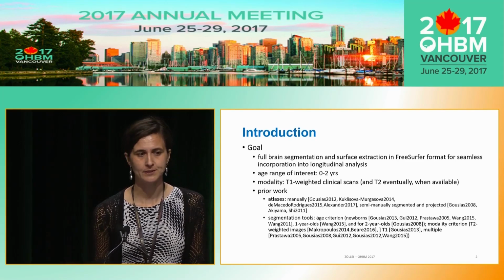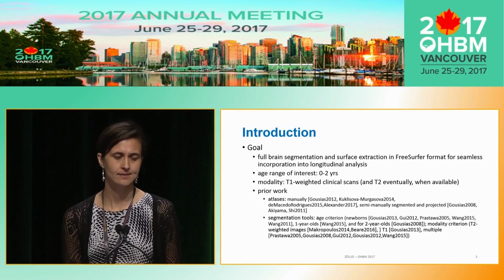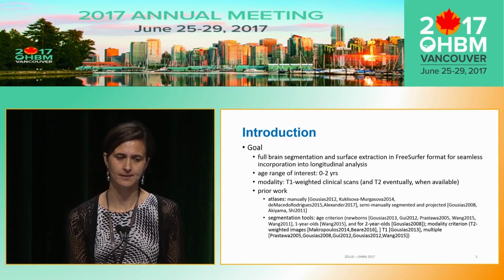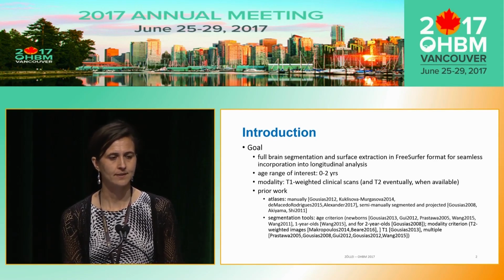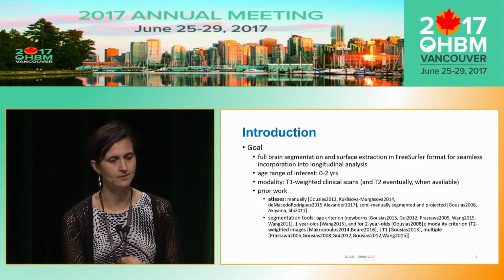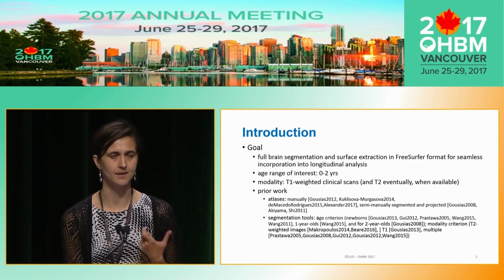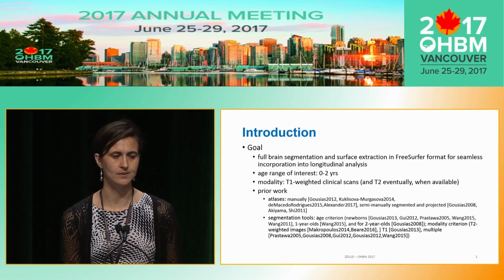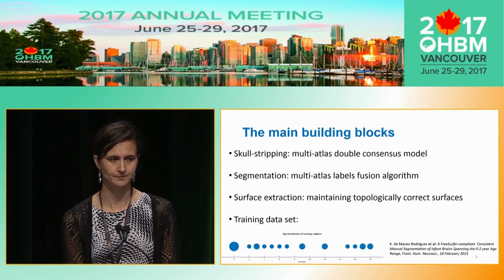Prior work, similar to ours, has been focusing on introducing atlases. These atlases were either manually outlined, semi-manually outlined, or projected from the adult space. And segmentation tools that are oftentimes age-specific, specific to, let's say, neonates, 1-year-olds, 2-year-olds, or they have modality restrictions. Let's say they are applicable to T2-weighted images. They require both T1 and T2-weighted images, or sometimes even diffusion-derived scalar volumes.